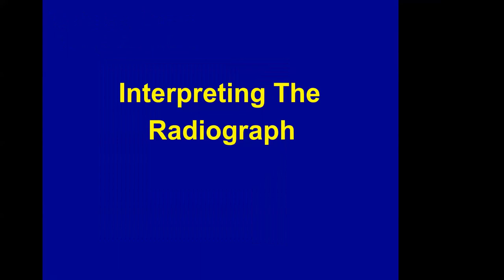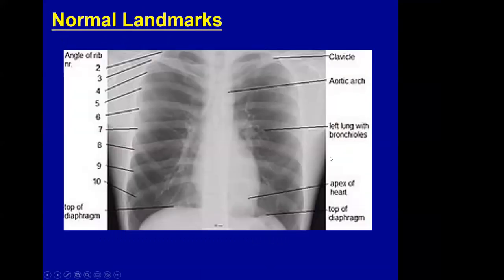Now let's look at how to interpret the radiograph. Looking at the landmarks, we can see the angle, the ribs, the clavicle, the aortic arch, the left lung with bronchioles, the apex of the heart, and the tops of the hemidiaphragms.